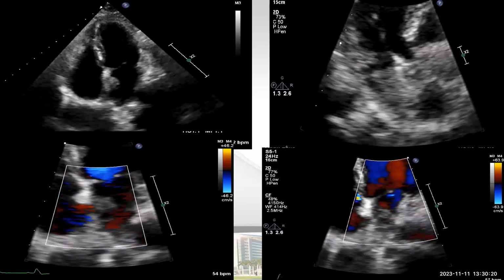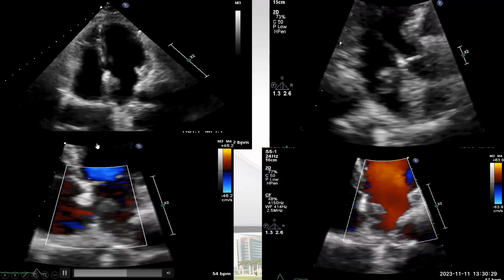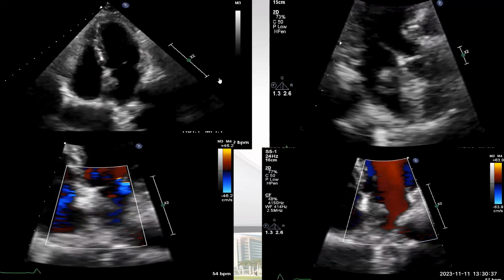So till now we have one answer, another answer. Okay, there is a good answer. He said this is an atrial mass, could be vegetation, could be tumor, mostly myxoma, and we have severe LV dysfunction and atrial enlargement.